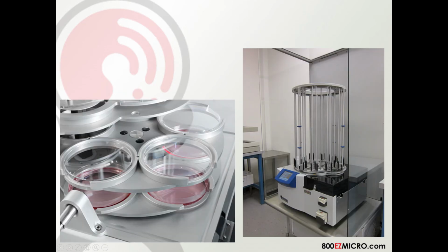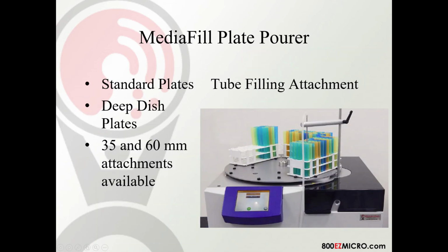So in the filling chamber, this is just the filling chamber of the unit, and what you will see on the right-hand side is we also offer a clean bench that allows the MediaFill to be placed inside of a laminar flow hood for use. The system is very sterile. Probably 95% of all the instruments that we sell are just operated directly on a bench with no problems with any type of sterility issues. However, if you do want to make sure that you are belt and braces covered, then we can do that with the clean bench that we offer.